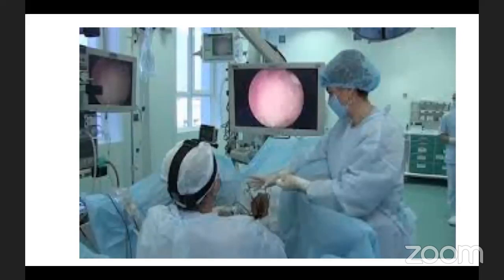If you've got many monitors, you can put one directly in front of the surgeon and the other on the side for your assistant, who will be looking to the other side as well.